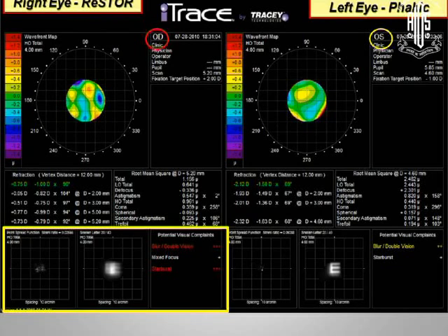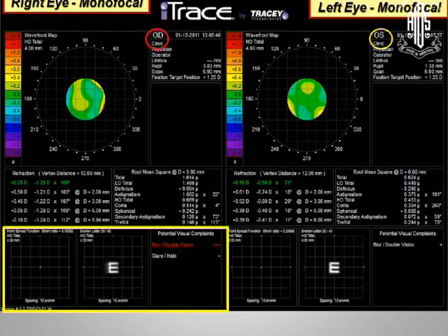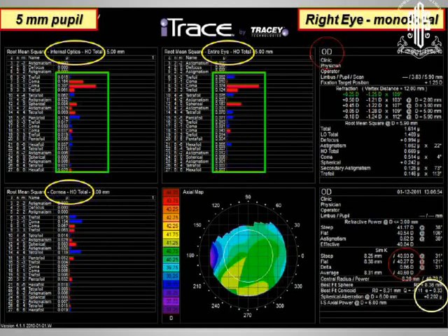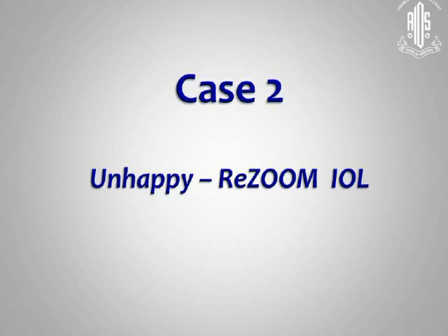Remember now, this is like point spread function. The blur there is assuming he was wearing glasses, and this is with a monofocal lens. So you can see the difference. The only difference between these two photos is we've got the monofocal lens in there. So his optical, now here's his wavefront. Remember, the upper is the total eye. This is the internal optics. This is the external optics. And now look. So he still has a little bit here, but dramatically reduced, and he was extremely happy.